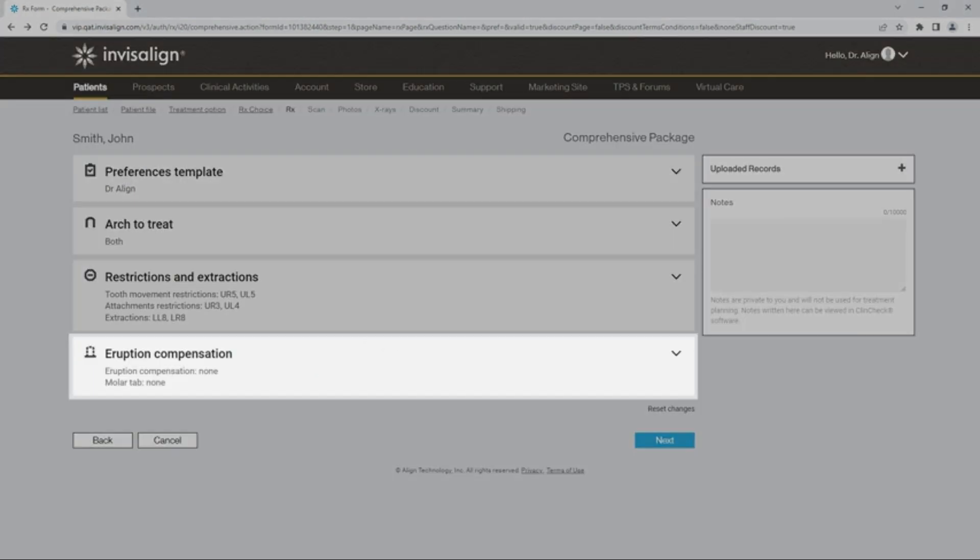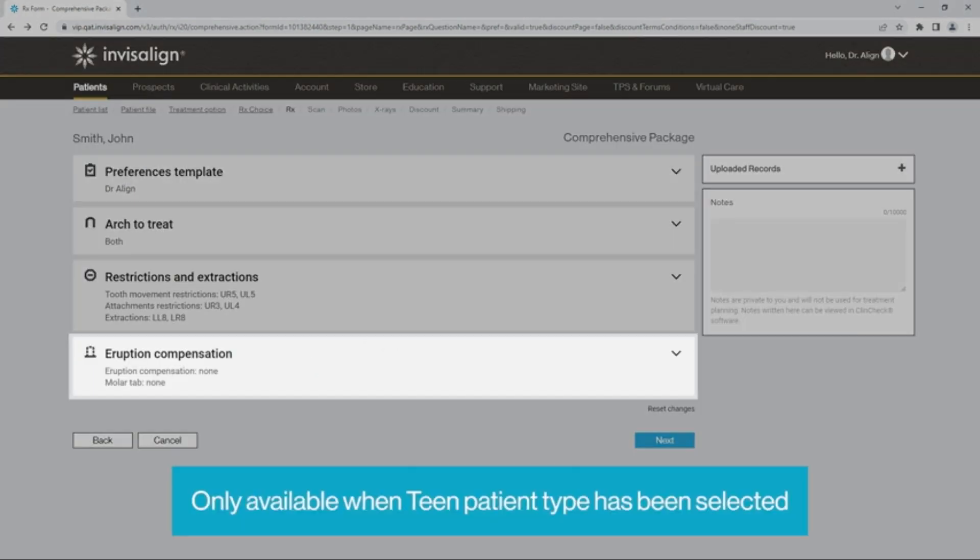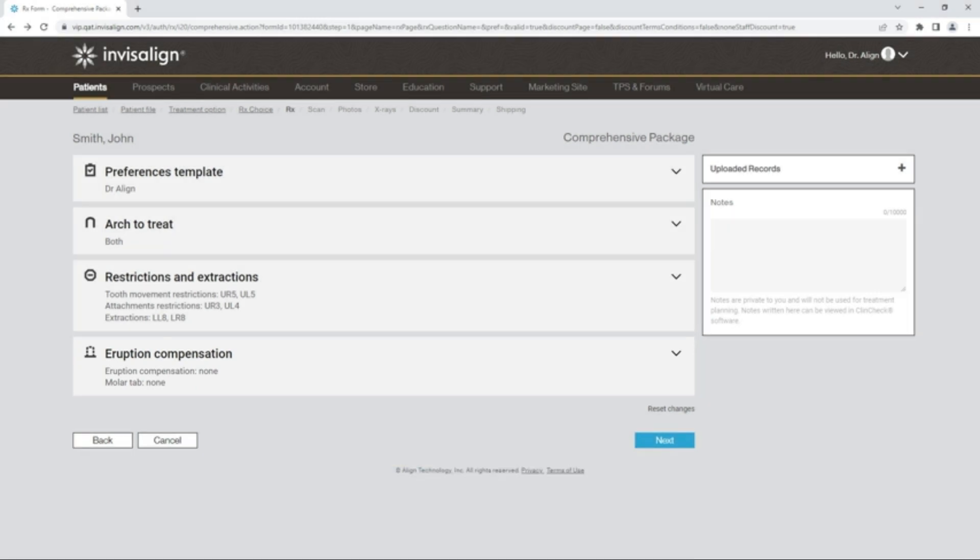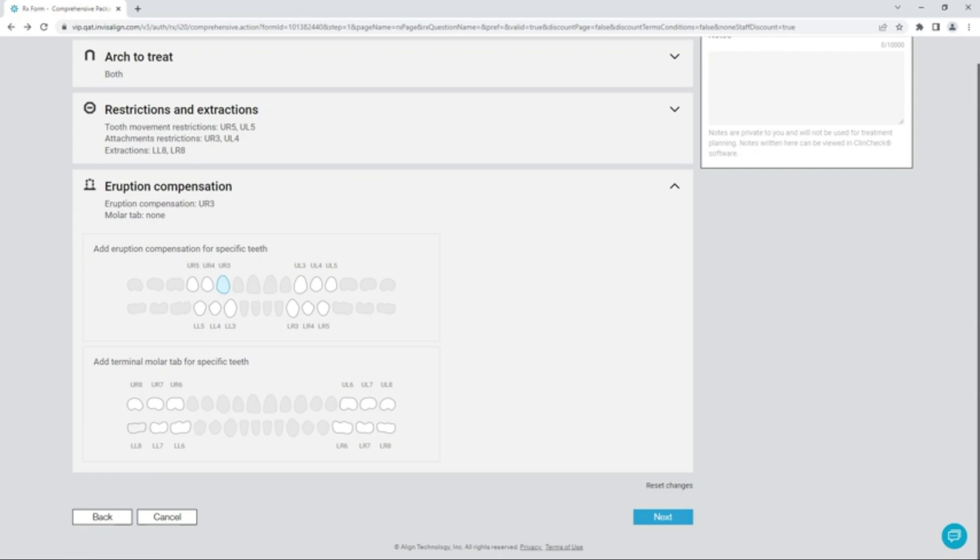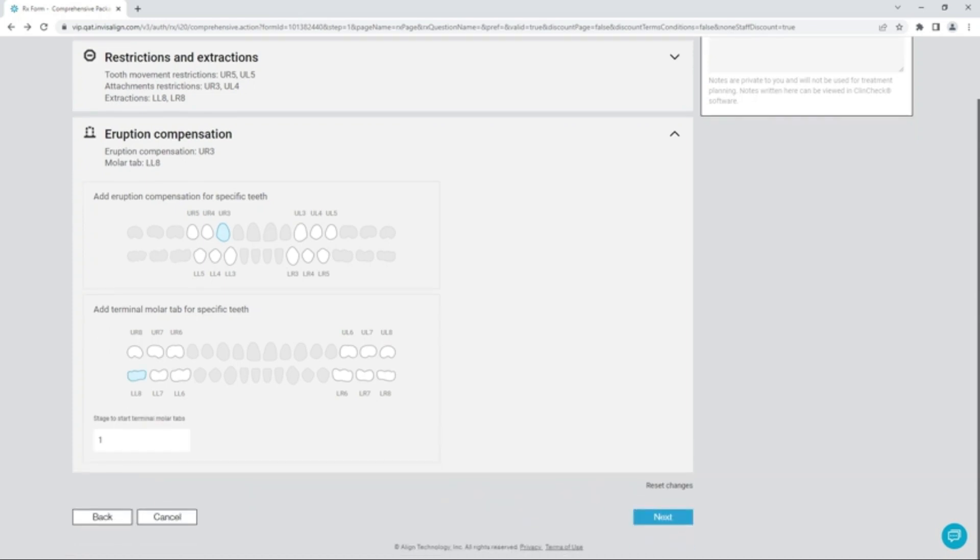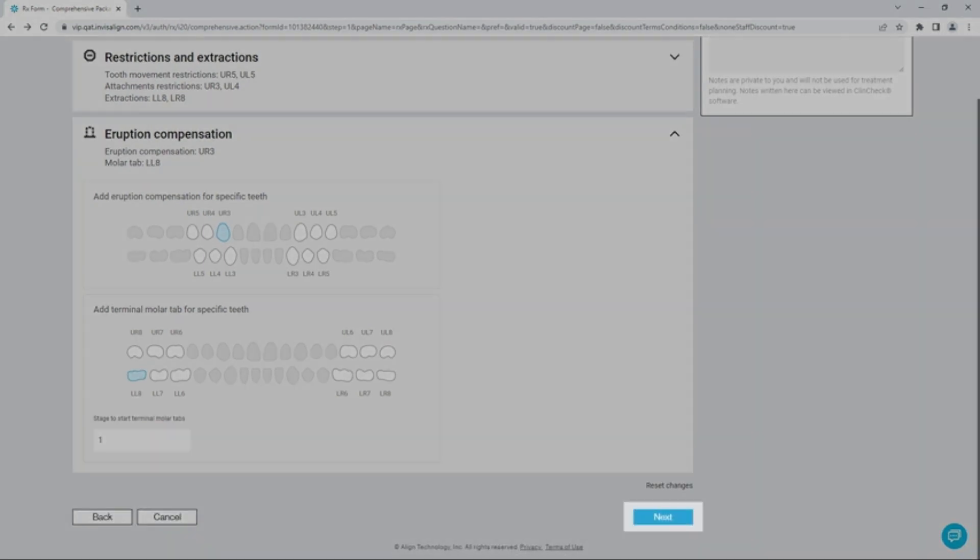The last tab is the Eruption Compensation tab. Please note that this tab is only available if you selected the Teen Patient Type. Select which teeth you want to have eruption compensation as well as the Terminal Molar tab. Click Next.